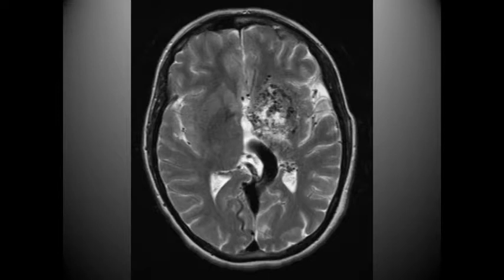Here is an AVM, and we can see it in this area. While it doesn't look as impressive as it does on CT, we do see that there is an abnormality there, and it really has created a lack of symmetry in this person.